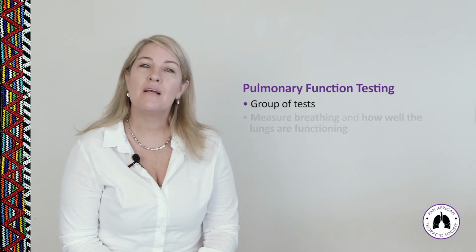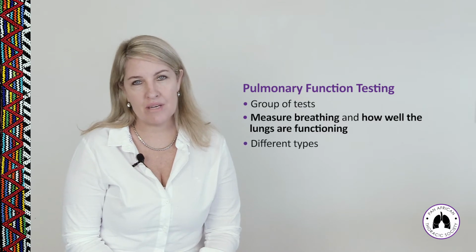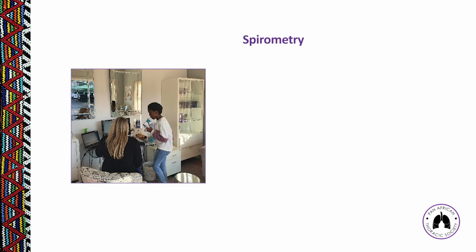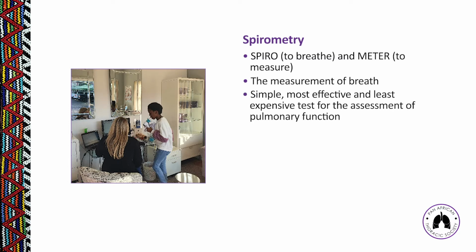So what is pulmonary function testing? Pulmonary function testing are a group of tests that measure breathing. They measure how well the lungs are functioning. There are different types of pulmonary function tests that can be done, and spirometry is one type of pulmonary function test. So what is spirometry? Spirometry is derived from Latin words, spiro meaning to breathe and meter meaning to measure. So essentially spirometry means the measurement of breath. And spirometry is the medical name for this simple, most effective, least expensive test of lung function.